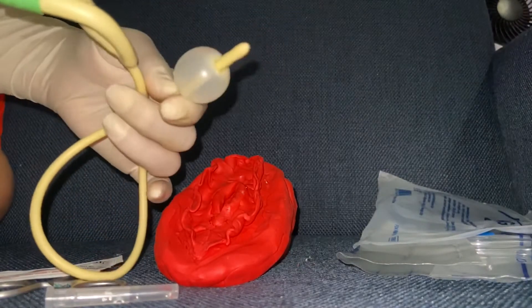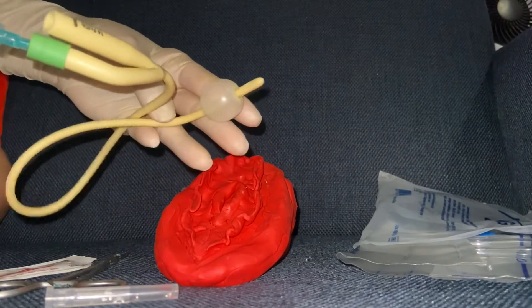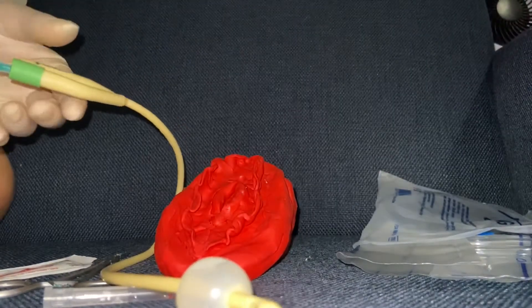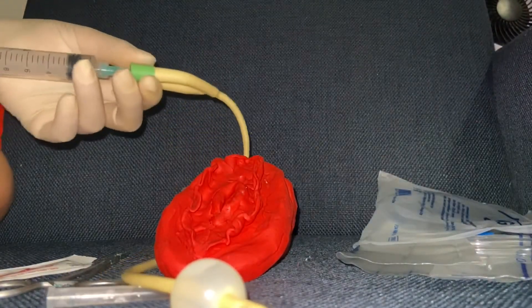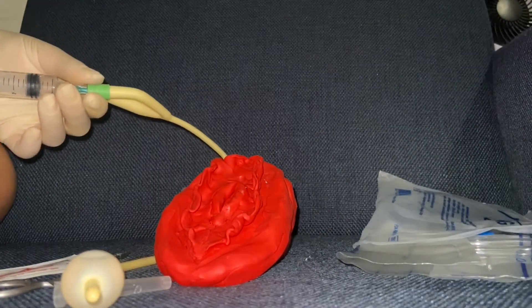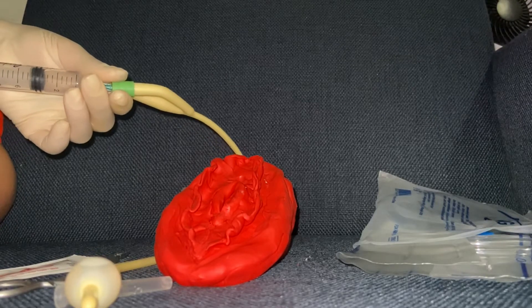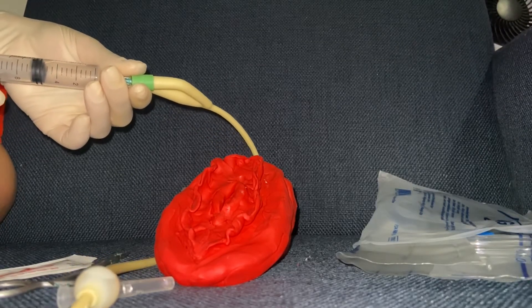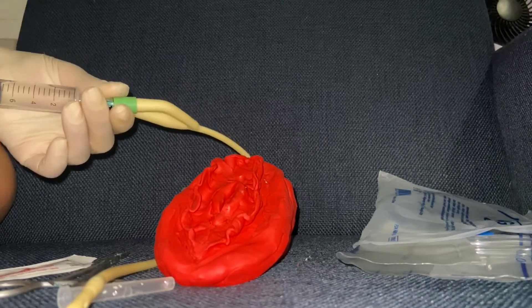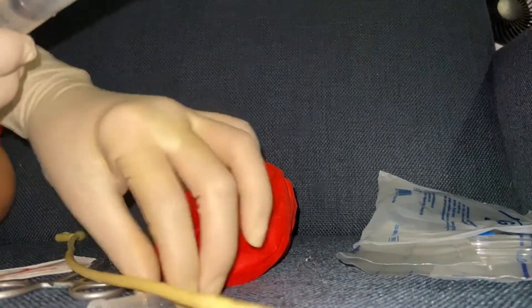As you can see, I have finished filling up the balloon and you will notice that there is no leakage, which means the catheter is not defective. After filling up the balloon, we will now aspirate the fluid back into the syringe, because the only reason we did that was to detect if the catheter is defective.